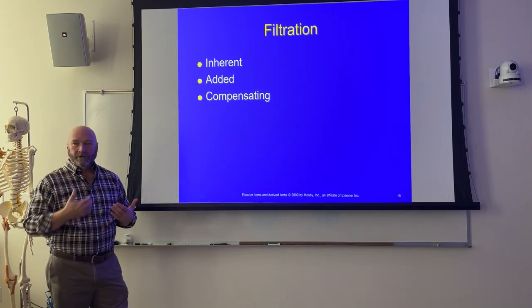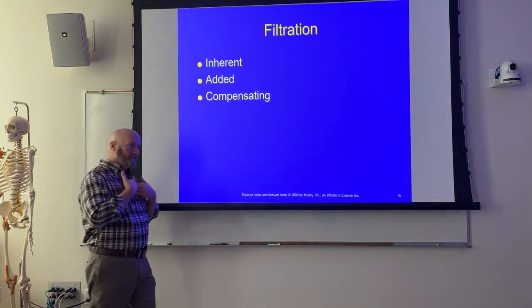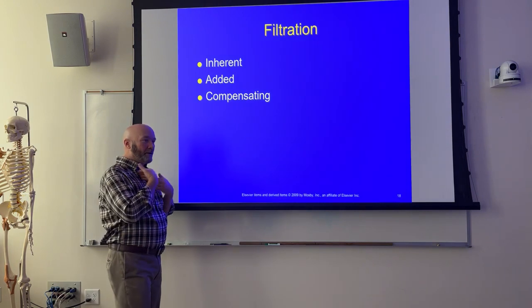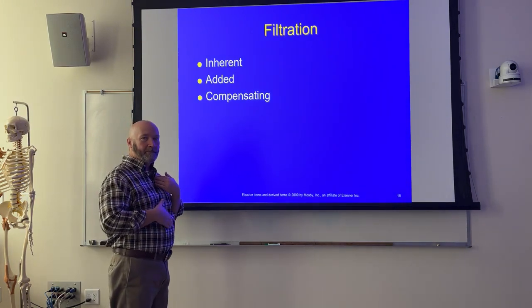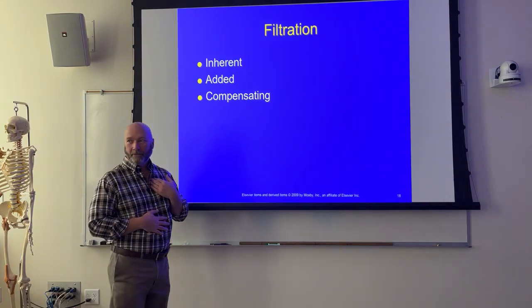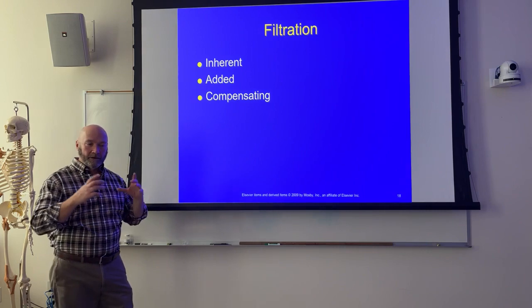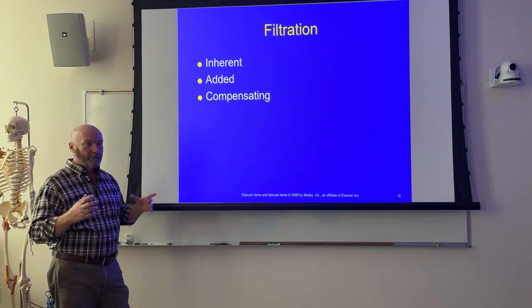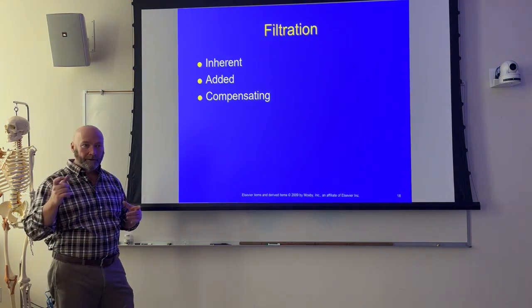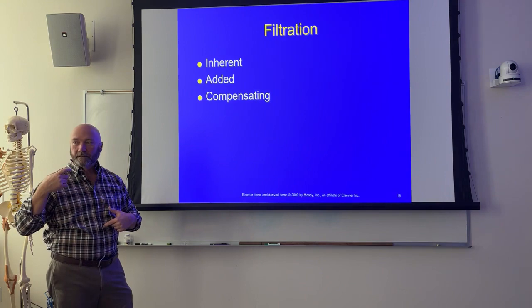If we made an x-ray, let's say of somebody's T-spine, all right, so y'all be gentle, all right? Where am I thicker? Top of the T-spine or bottom of the T-spine? Bottom, quite a bit, all right? So what we would do, to get a good AP T-spine, is we would use a compensating filter, a big, thick chunk of aluminum, put the thick end at the top and the thin end at the bottom.